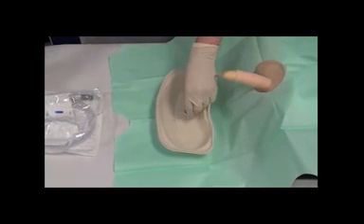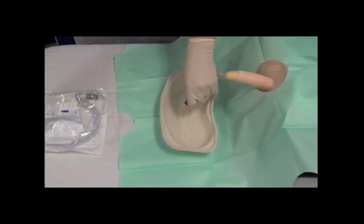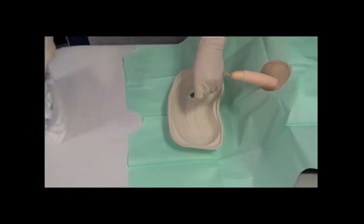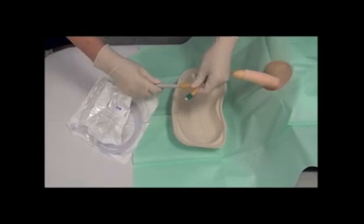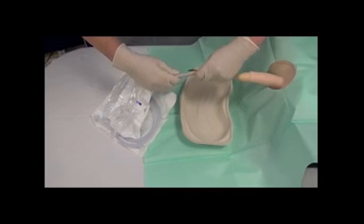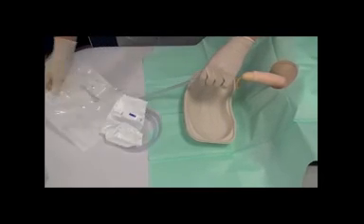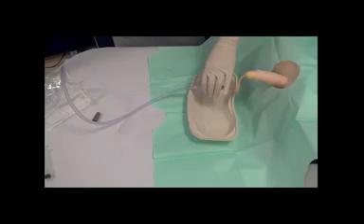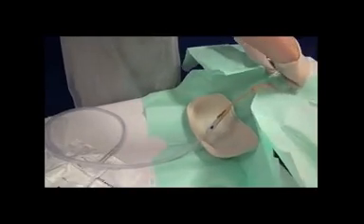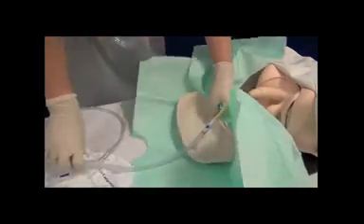Gently pull back on the catheter until you meet resistance, and then take the catheter drainage bag, remove the cover on it, and connect the two parts together. Replace the foreskin where necessary, and clean up any mess. Finally, tell the patient it's over and thank them.